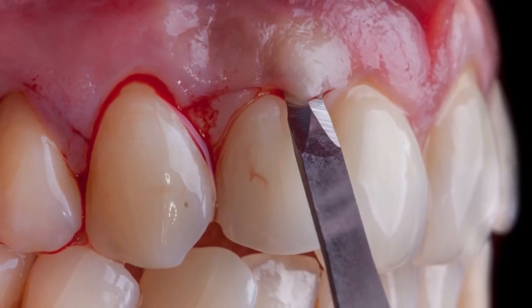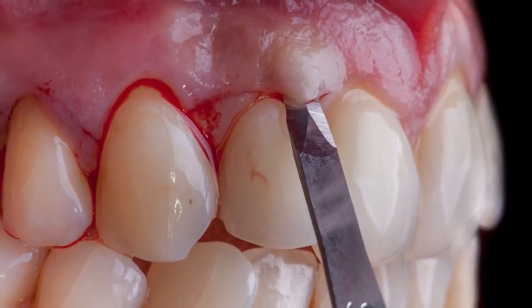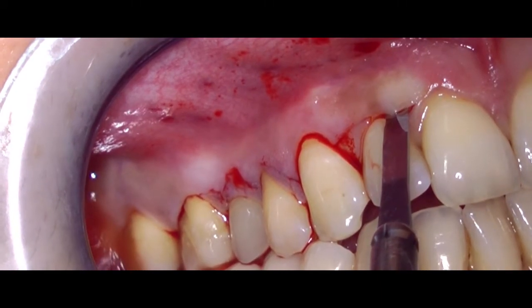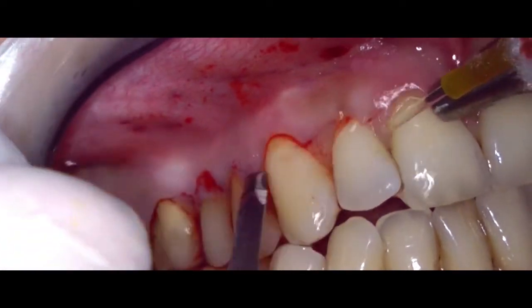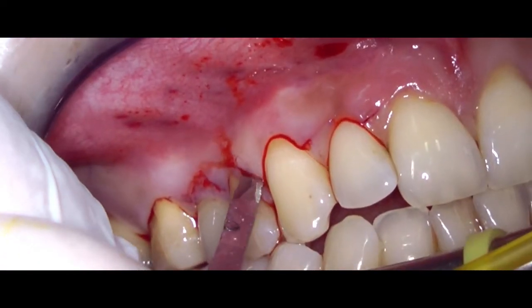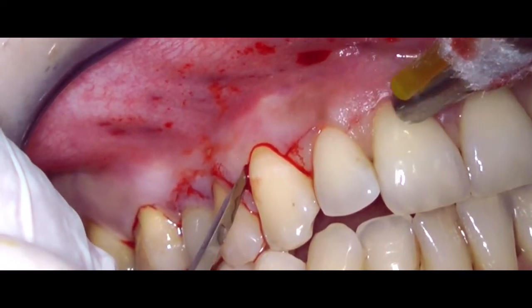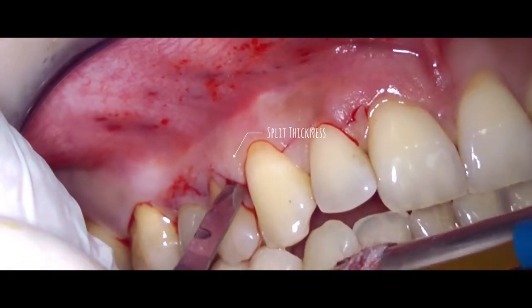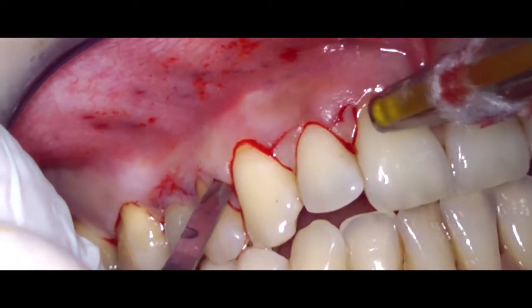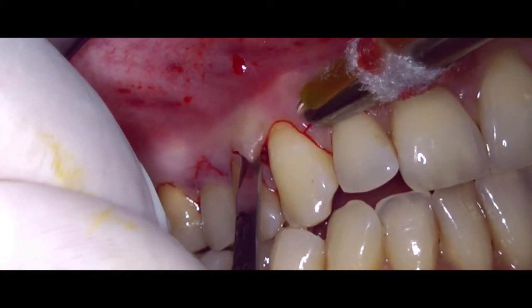So, an important aspect of this surgery is the variable thickness of the flap. The surgical papillae are created by split thickness. As we can see here, this blade position allows for the splitting of the flap, and we keep going like this until we reach the probable margin of the adjacent teeth.